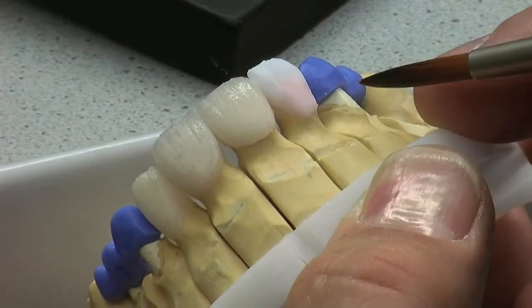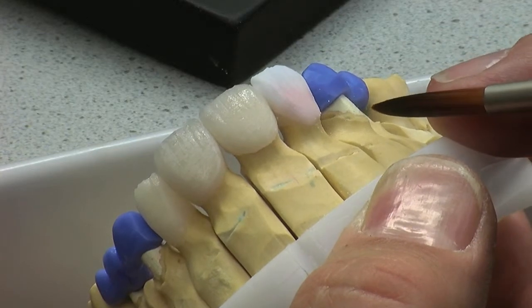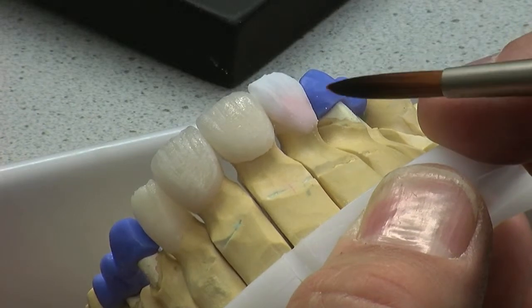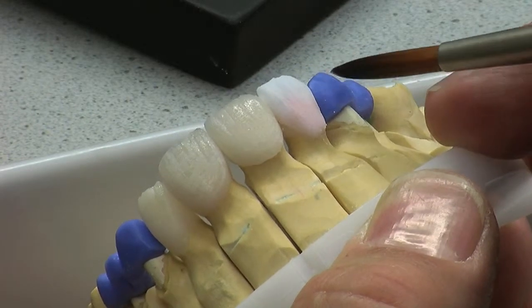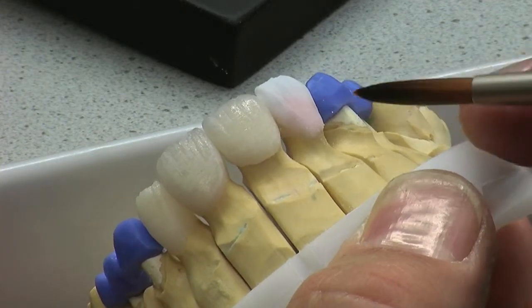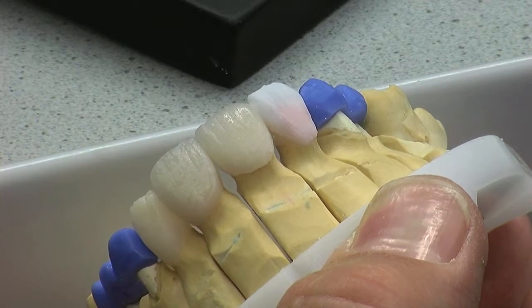I've now built up my lateral completely fully. I've got four different types of enamels on there and three different types of dentines. Very straightforward, very easy — colour comes from within. I've linked it up with my three here. We're now going to fire that up, and this process is going to be repeated throughout the arch until we've finished and delivered the case.